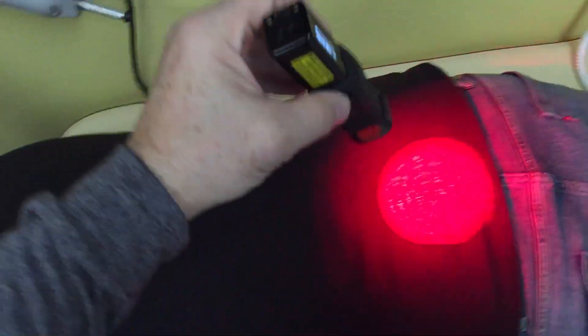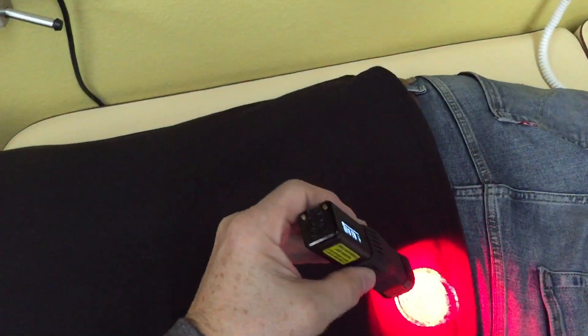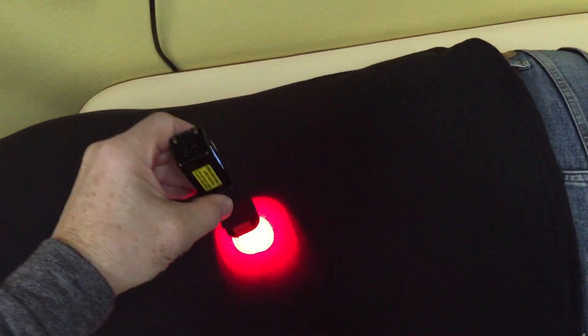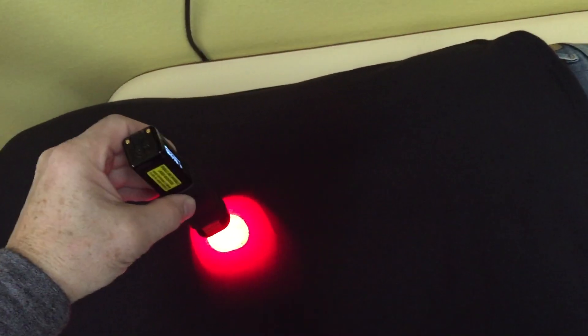I've cranked it up so I can increase it to this size, or I can come down and hit the areas that are acutely injured or acutely painful. This is a pain frequency set for treating spinal trauma and spinal injury.